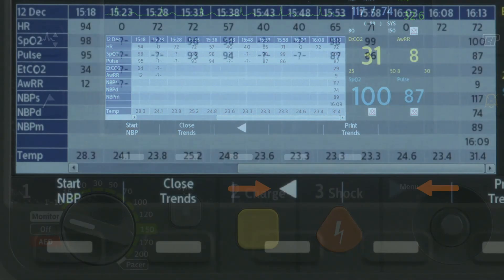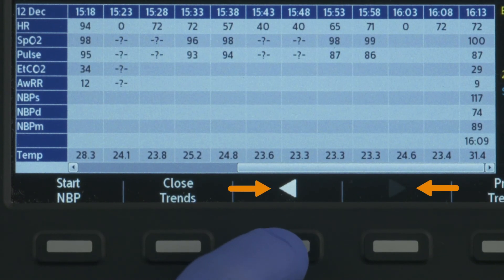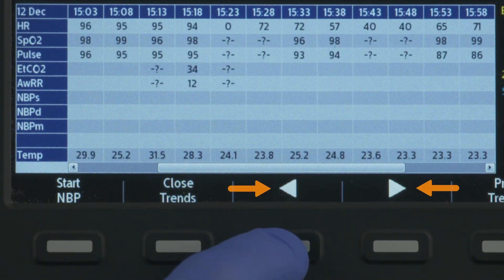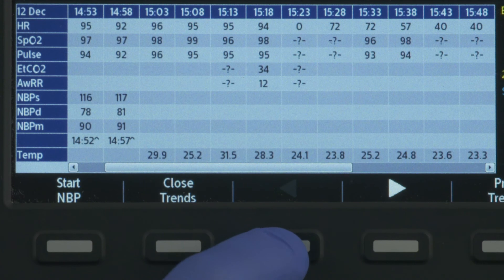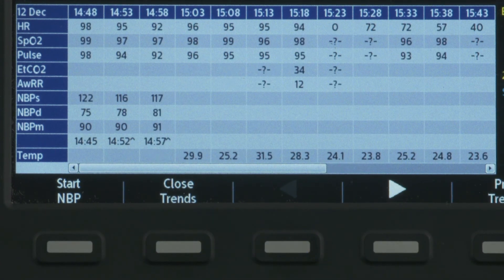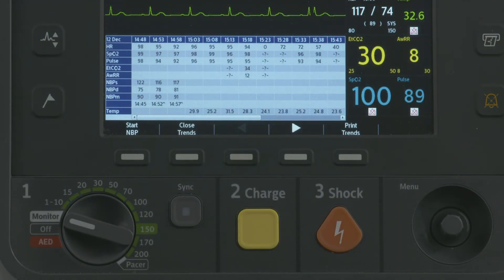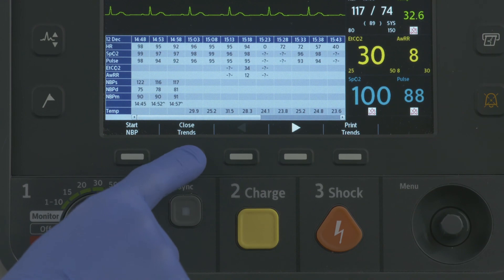Use these soft keys to scroll backward and forward in the VitalSigns trending report. When there is no more data in a particular direction, the soft key becomes inactive. To exit the trending report, press the Close Trends soft key.